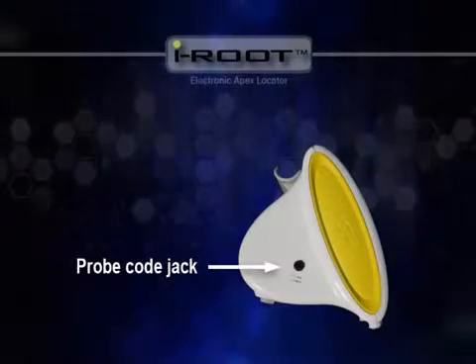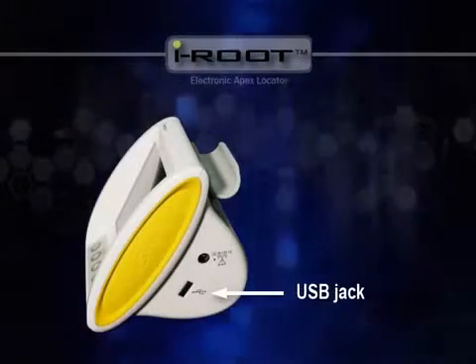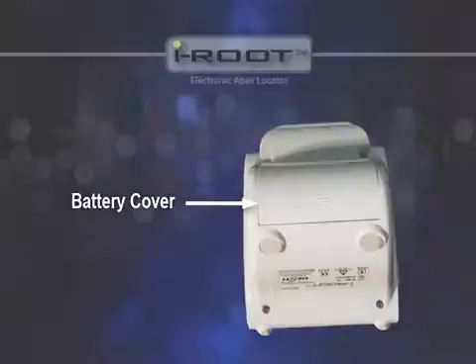On both sides are the probe cord jack, USB port for software option, power adapter jack for charging, and the battery cover is located on the back of iRoot.